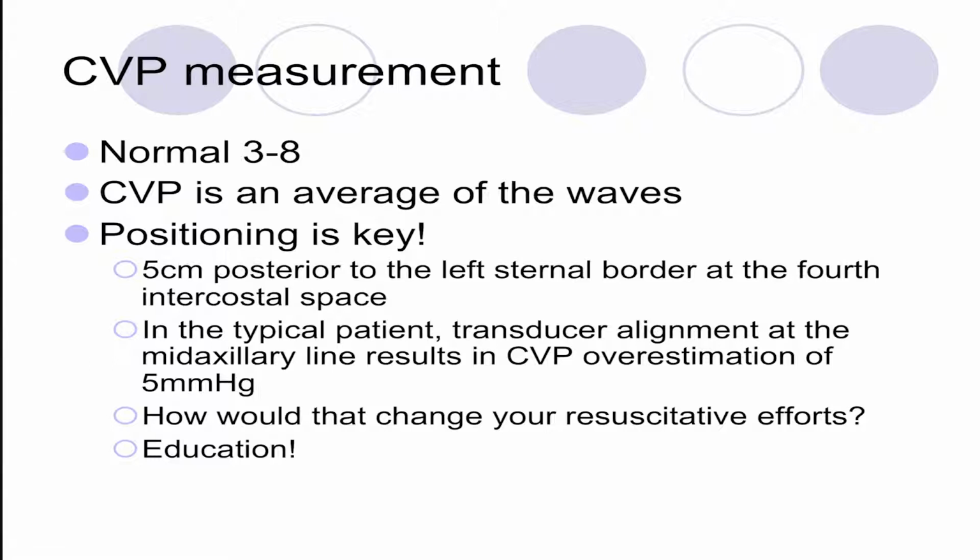Positioning is key. So, and I do it too, we hook these up and you eyeball, and yeah, these patients are big and the center of them is hard to find anyway.